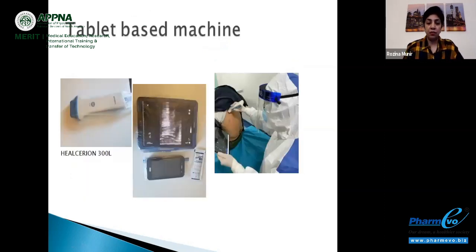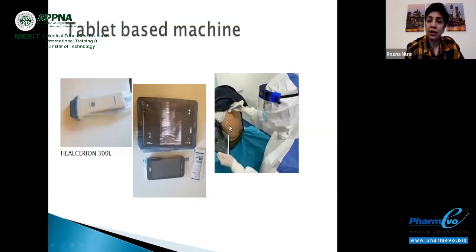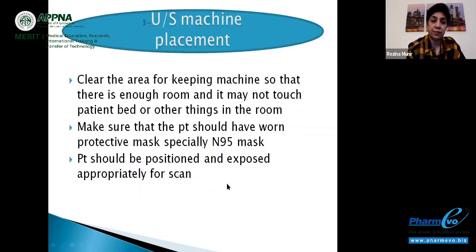If you see over here, this is the handheld machine. And you can see how convenient it is to use these machines for COVID-19 patients. The entire machine comes with the transducer in a small sheet. You can use your tablet or your phone, and cover it in an end-to-end plastic sheet. Even if you're not using any protective sheet, it is just these two units which can be very easily cleaned. So this picture shows that even if you're not using any sheet, it's easy to clean them afterwards.